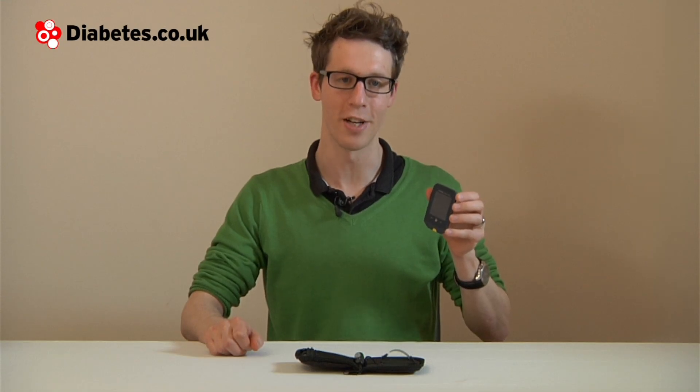The meter also offers insulin dose suggestions. It gives background insulin dose suggestions if you take fasting blood glucose tests and record fasting results outside of your desired range. The meter also offers mealtime insulin dose suggestions — so if you have a high level before lunch, the meter will take your normal dose into account and add an additional correction factor to help bring your levels back down to normal.